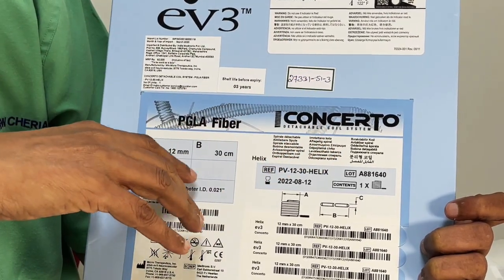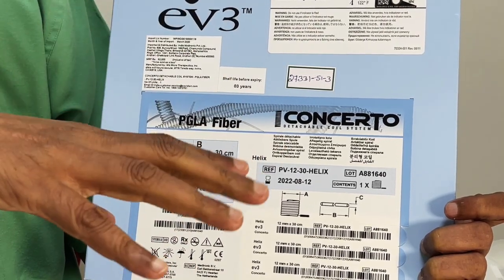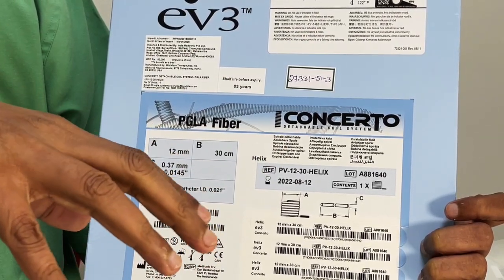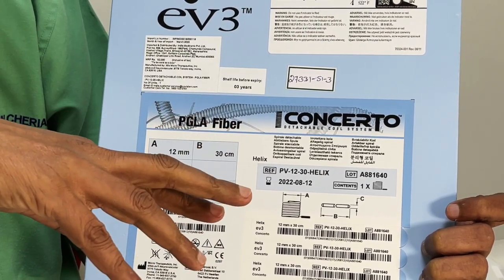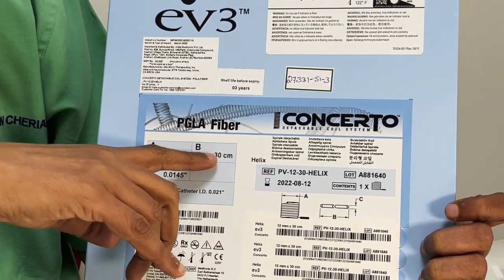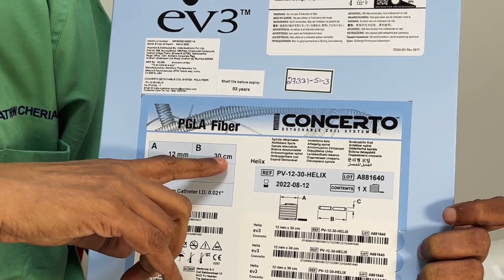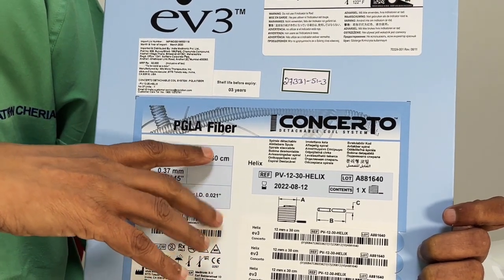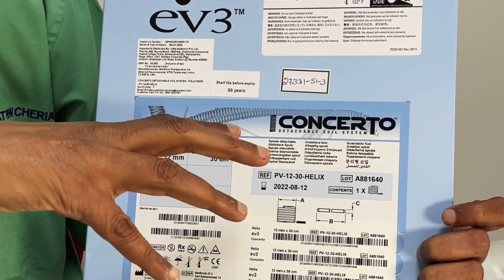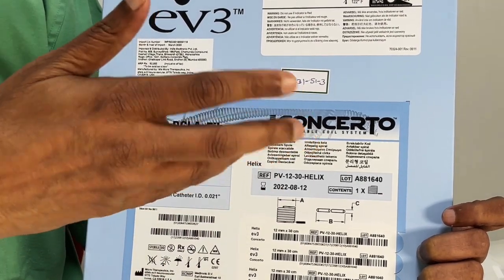But having said that, it is nowhere close to the platinum fibered coils that we get from Boston Scientific or from Cook. The thrombogenicity is much lower, but the advantage is they come in very long lengths. For example, this is 30 centimeters. So technically, it is like two of the other coils being put in. So although they are expensive, in terms of actual cost, it is not so, because it's almost the cost of two coils that you get on the other side.